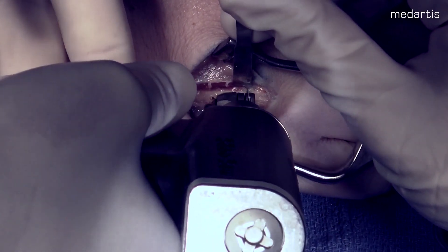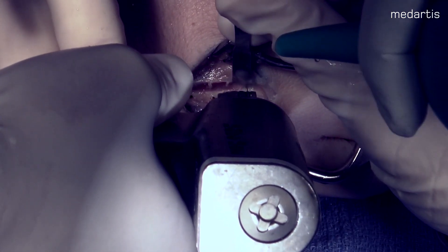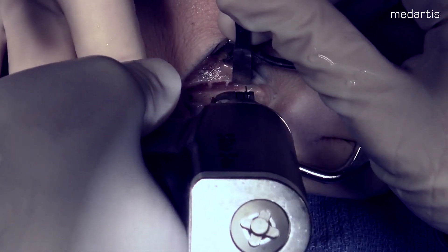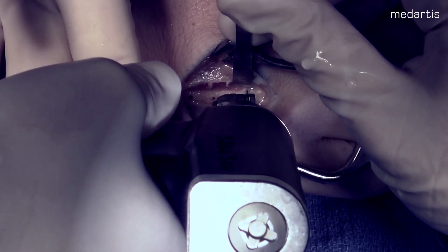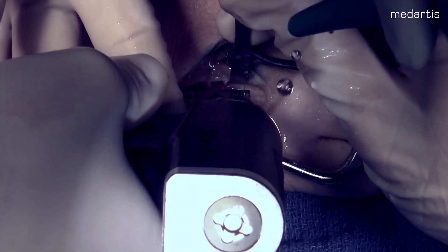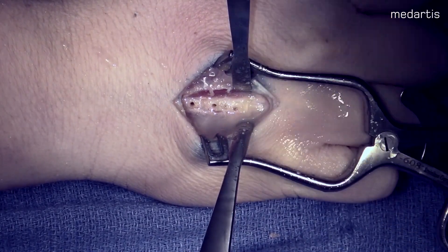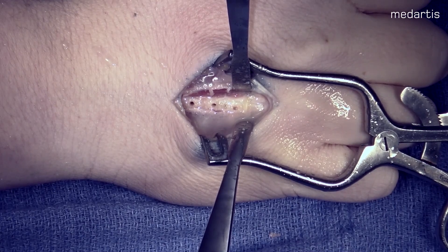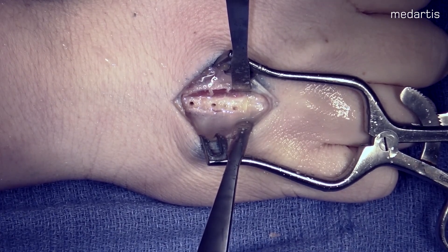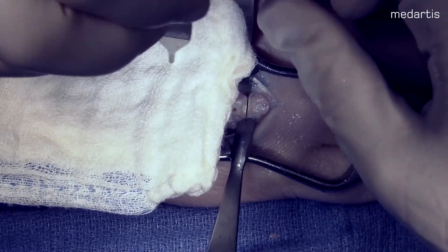After removal of the plate, I make a transverse osteotomy perpendicular to the metacarpal. While making your osteotomy, it is important to use irrigation in order to decrease thermal necrosis at the osteotomy site. Here you can see that our osteotomy site is complete and we have freedom of motion through that osteotomy.